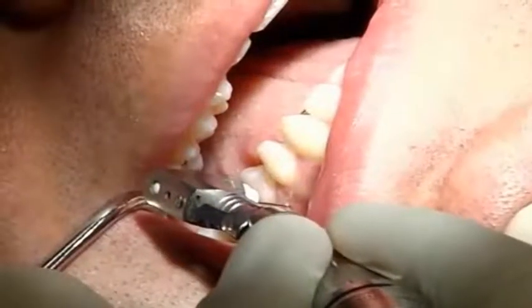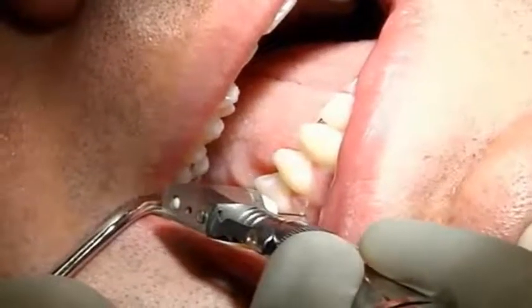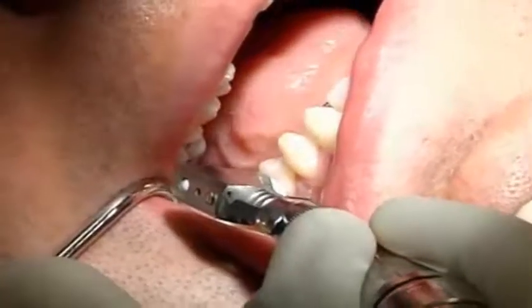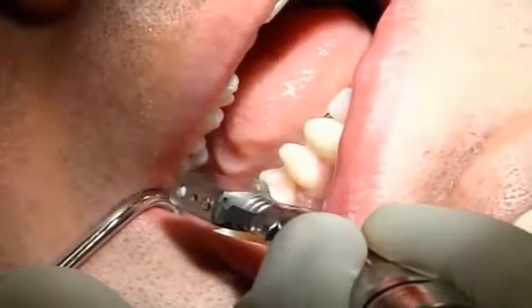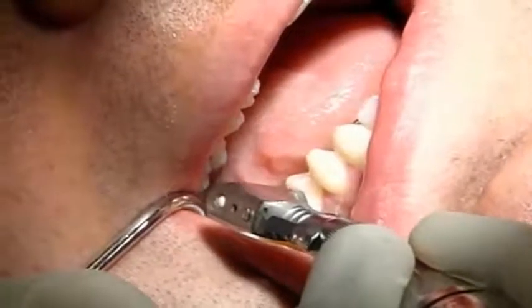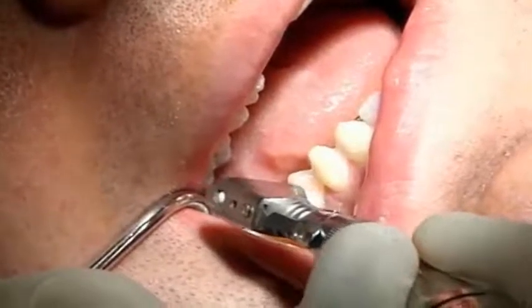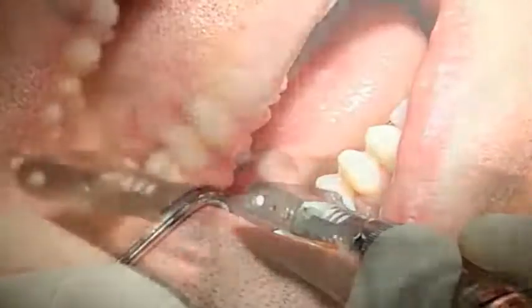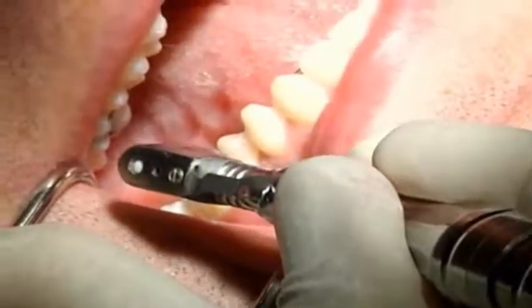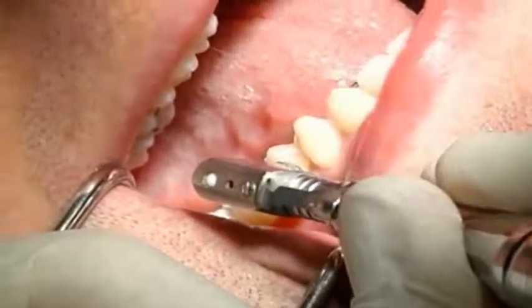The perforator or number 2 round bur is positioned and advanced slowly. Use alternating pressure or a type of pecking action. If the perforator is not advancing, it has become dull and must be replaced. If it is not replaced, the perforator may bind and break, or create frictional heat and burn the bone. The perforator has been replaced and this alternating pressure is continued until the perforator drops through the cortical plate and into the medullary bone.